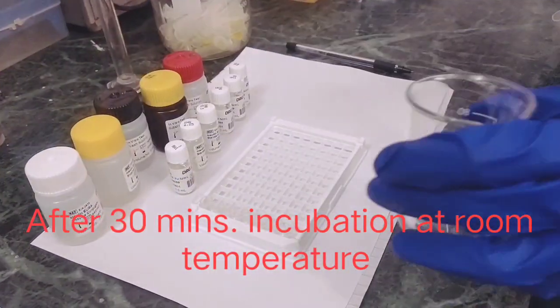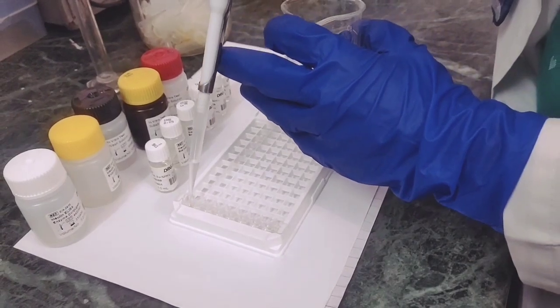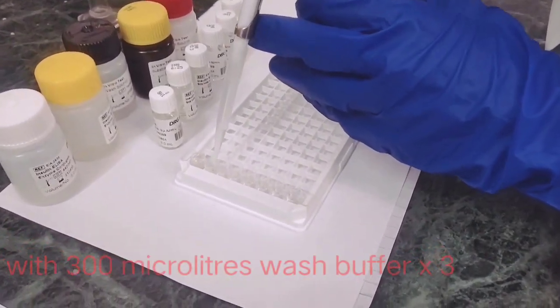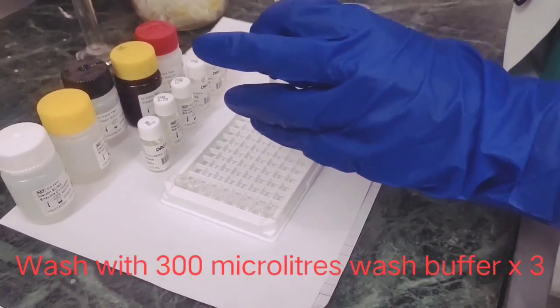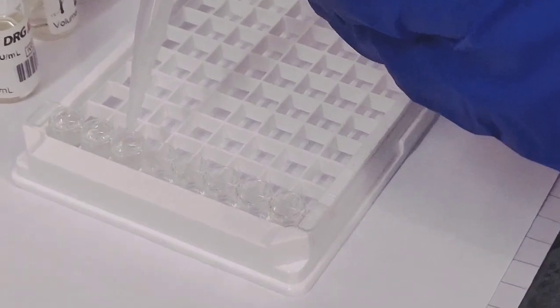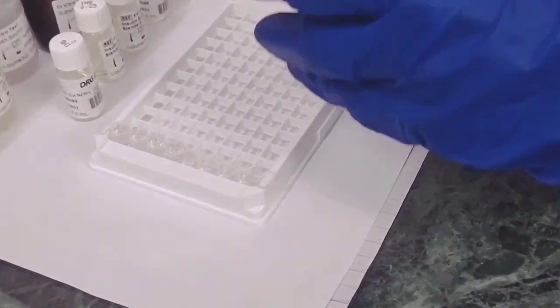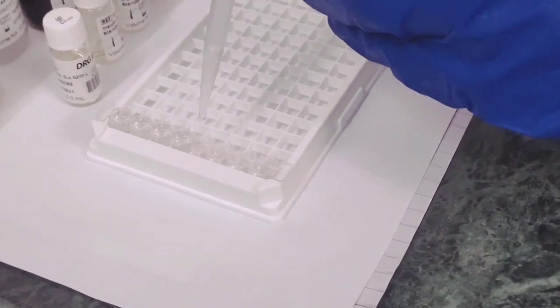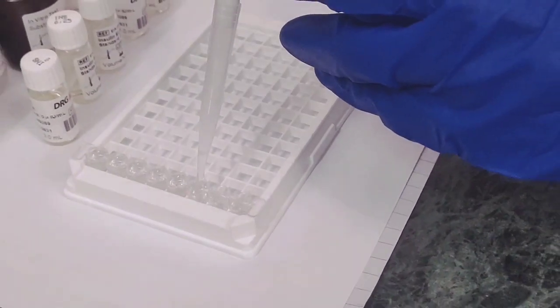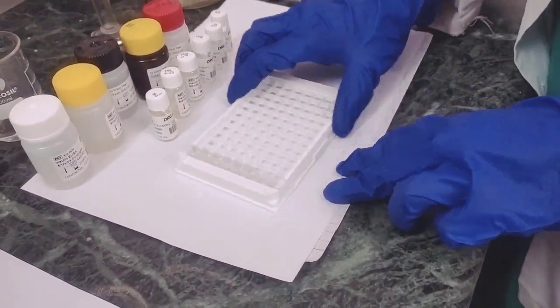Now we'll proceed to the next step, in which we will wash each well with the wash buffer. For this we are taking 300 microliters of wash solution of 1x concentration in each well. We have to do washing 3 times.